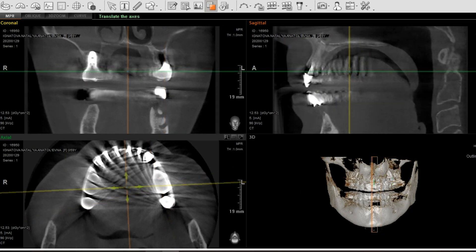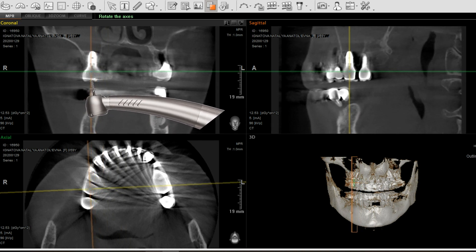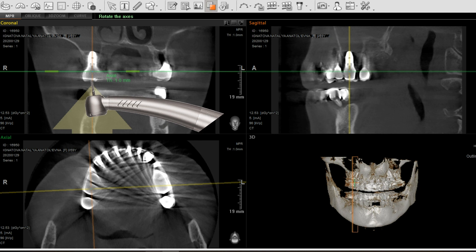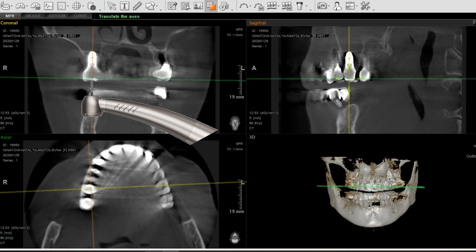Before drilling the crown, it is necessary to set up CBCT navigation. The most convenient way is to set the transversal and sagittal planes along the implant axis in MPR mode, and move the occlusal plane to the upper third of the coronal part. This way, the transversal and sagittal planes will give you the inclination relative to the coronal part.